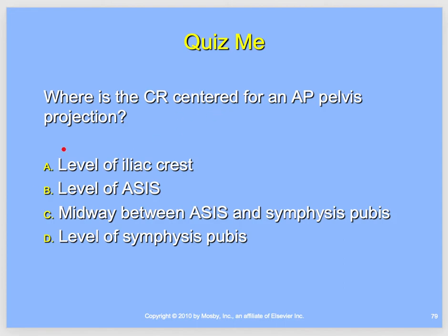All right, so we're going to start some quiz-me's here. There's just a few of them, and then we'll be done with this.